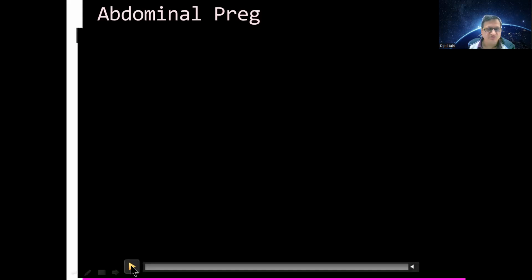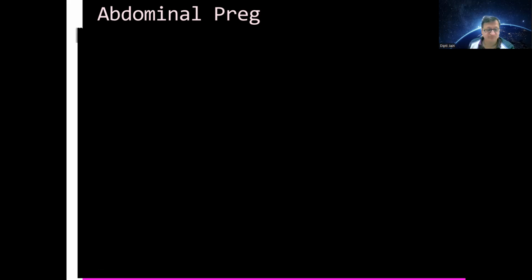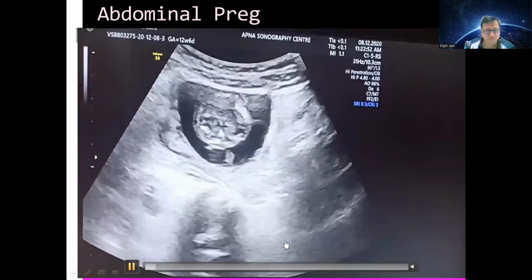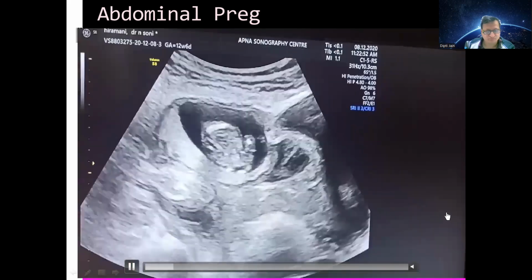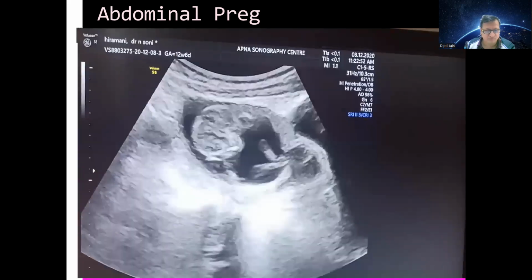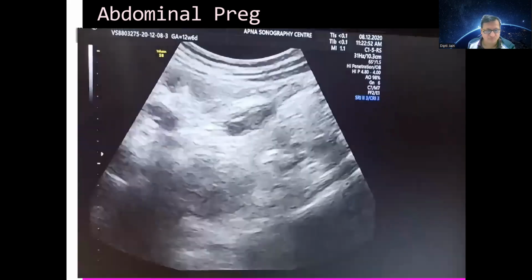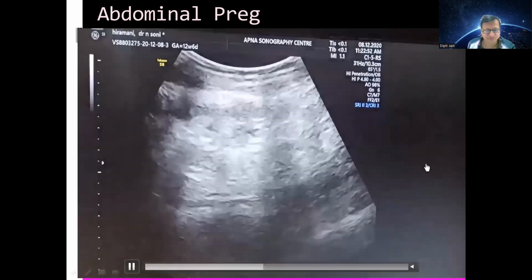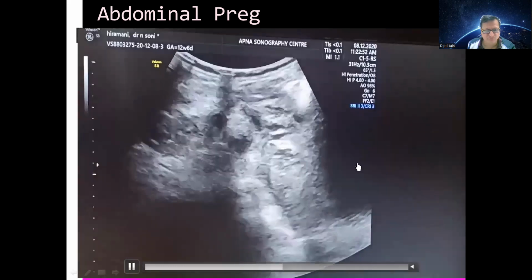This is the video of the abdominal pregnancy. This is the sac in the abdomen.